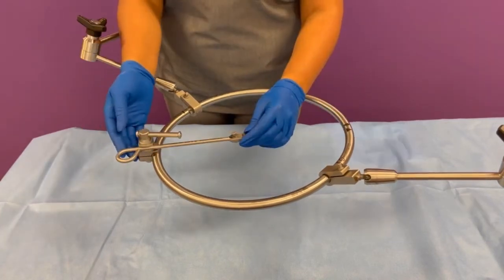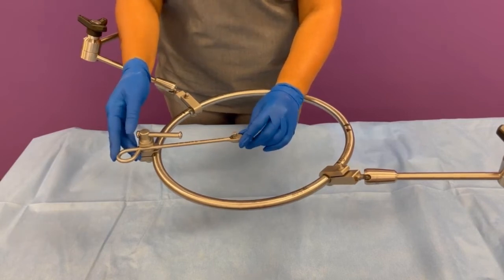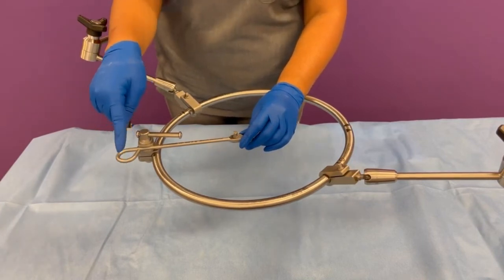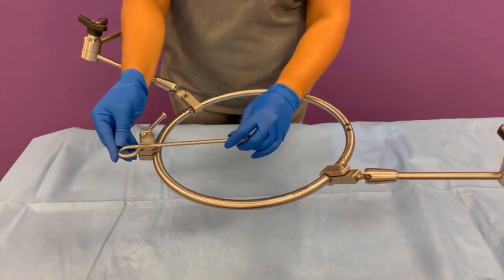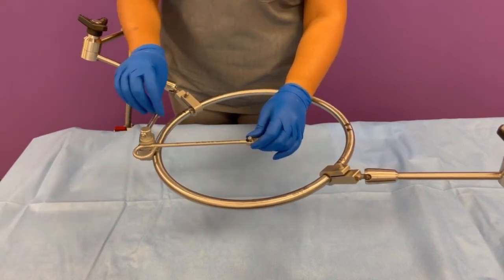One thing to keep in mind when assembling this AL-103 ring clamp is to make sure that the loop of your blade holder is pointing away from the ring clamp. This will ensure that if a further reach is needed, you can use the rest of that extension for more of a reach.